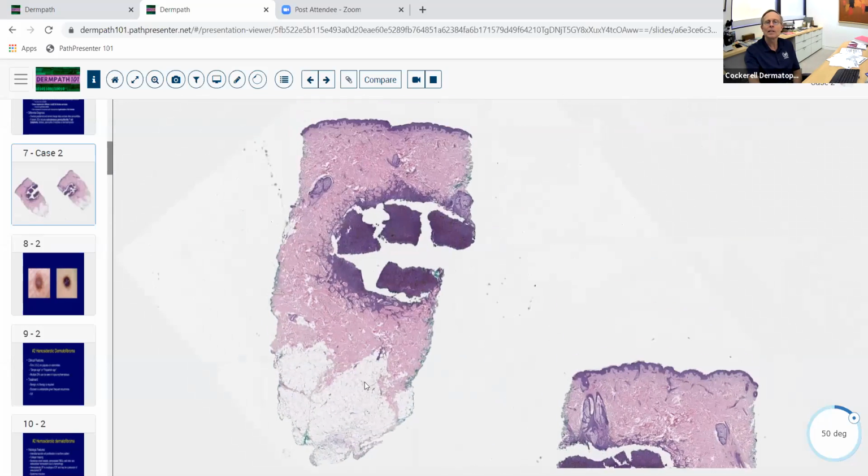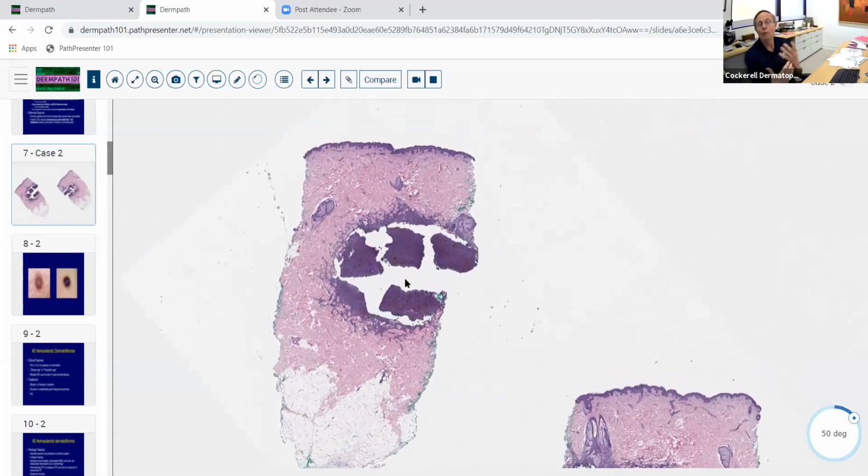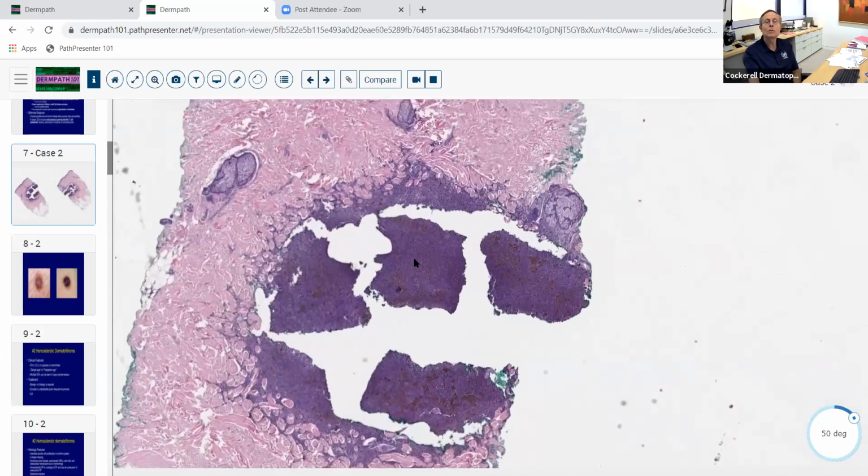And that's because basically the cell types often fall apart from one another. And so when you actually make a slide of it, basically it's just discohesive. So what kind of cells are these? Well, low power, all we can kind of say is they're sort of purple. Is it an inflammatory or a neoplastic process? Well, it's hard to be sure, but we say, well, if it's a neoplasm, is it going to be benign or malignant? Well, it's a small round nodule in the dermis. It looks relatively symmetrical, so it's going to favor benign, just looking at that. Is it going to be epithelial or non-epithelial? Kind of hard to see here at this power. So let's go to higher magnification and see if we can kind of tell what sort of cells they are.